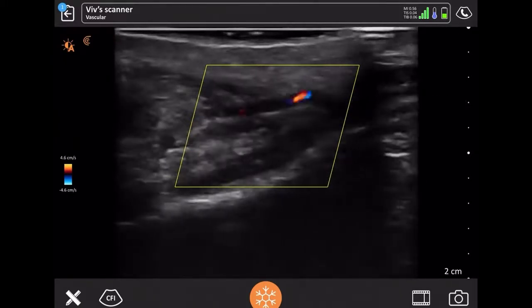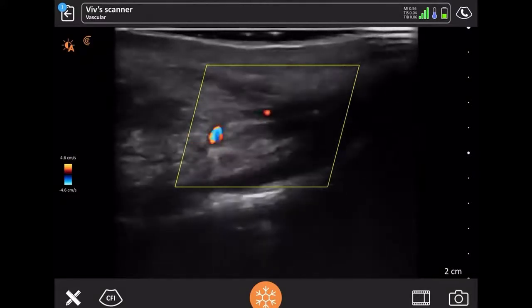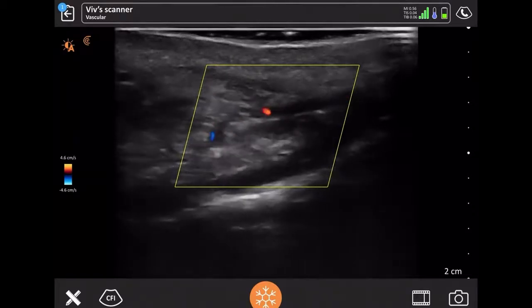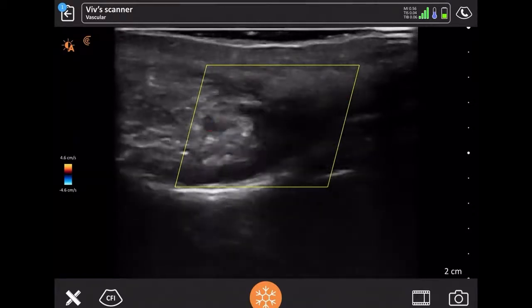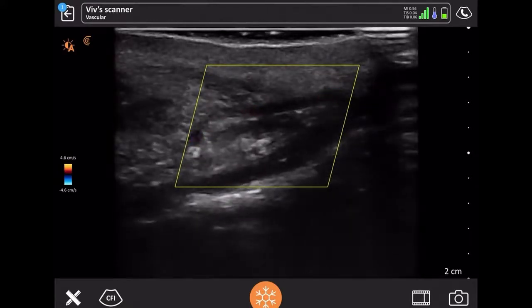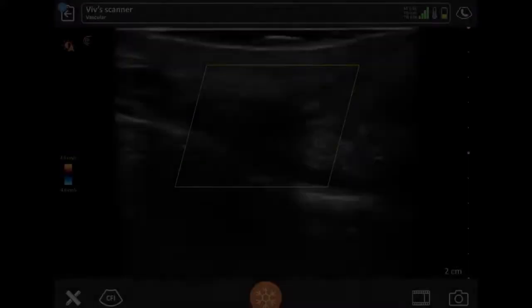So this is the area just around my nose to mouth area, just in that small area where lots of injections are carried out for different patients. The problem is if injection is carried out in the wrong place and filler ends up in a vessel, it can cause all sorts of problems, unfortunately. So I'll be talking to Sunny about that.